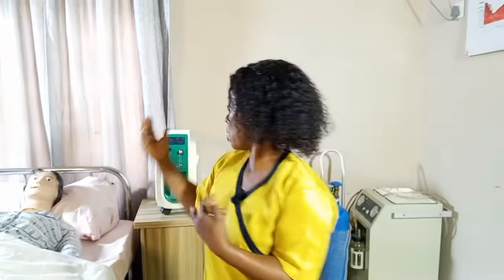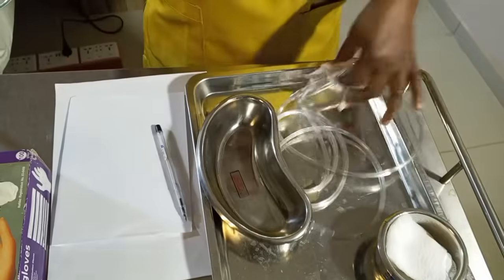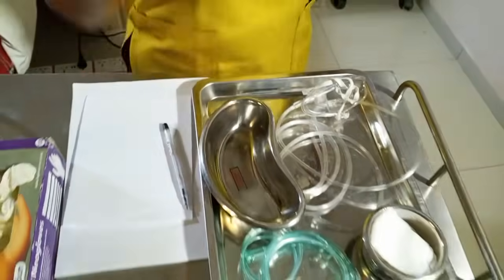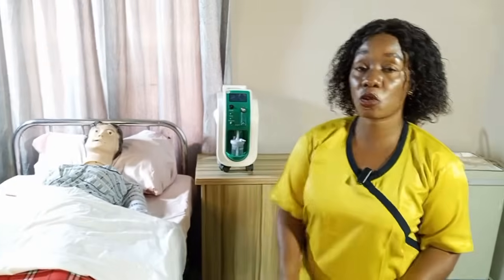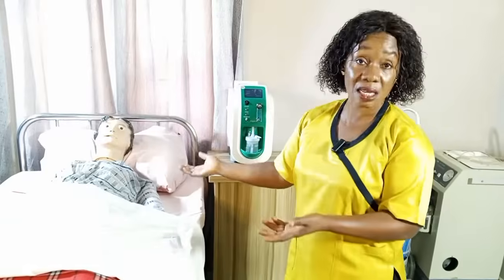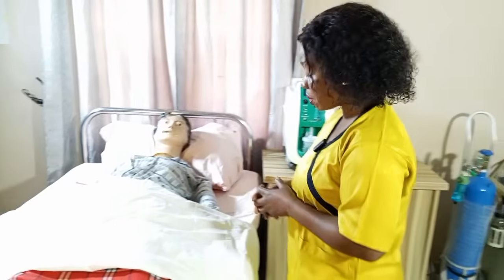Your requirements must be ready. My oxygen concentrator is ready and my tubing is ready — either nasal prongs or a nasal face mask that you are going to use to administer the oxygen. After setting your requirements, the next thing is to identify the patient. My patient is conscious, so I can take informed consent and identify my patient.